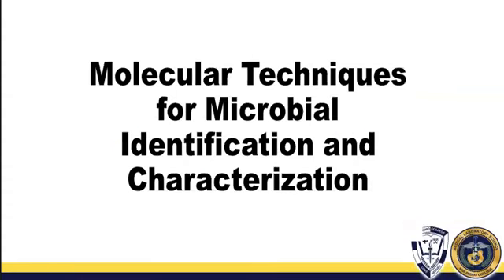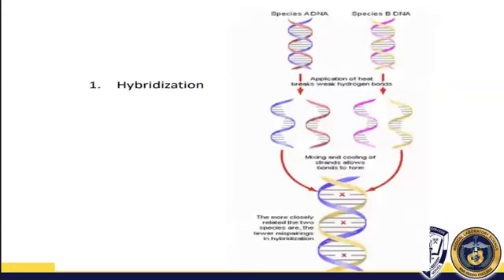And of course, if you have your PCR, you can always perform molecular techniques for your microbial identification. So one example of molecular assays that we could do to identify your bacteria would be hybridization. So DNA hybridization methods are usually used to identify genomic species. Okay? Pero all of these methods are really time consuming and they are laborious, no? It can only be applied in special situations. So pwede tayong gumamit ng quantitative bacterial dot filter or yung nitrocellulose filter method.